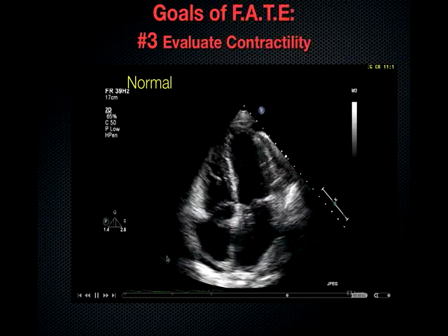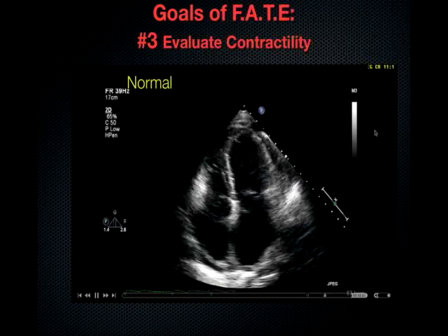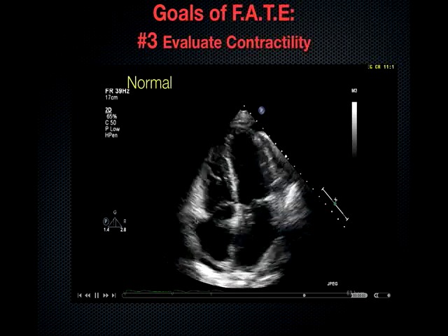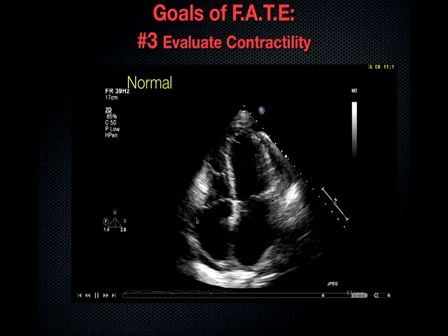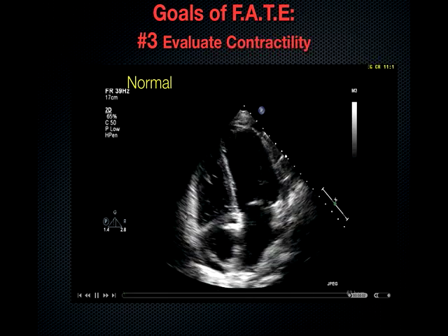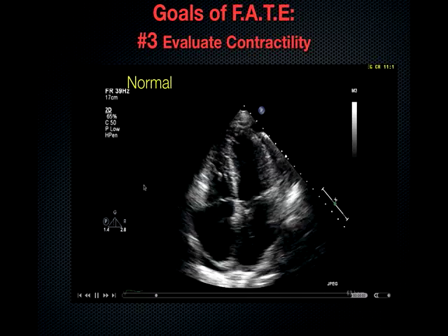Again, we have the left ventricle thickening and coming towards the midline with the chamber size change 40 to 50%. We also have the right ventricle contracting. And to focus here, and we'll have other talks that specifically focus on the ventricle, what we're looking for here is right here, where the tricuspid valve attaches to the lateral wall. That's the annular plane, the tricuspid annular plane, and what we're looking at is to see it move towards the apex in this direction about 2 centimeters with each systole.